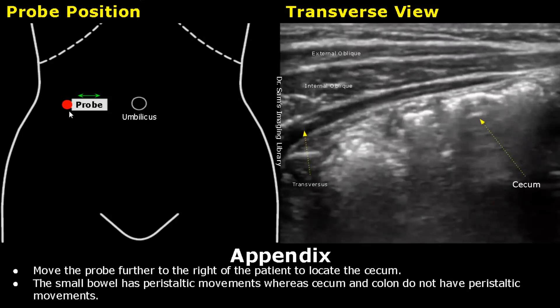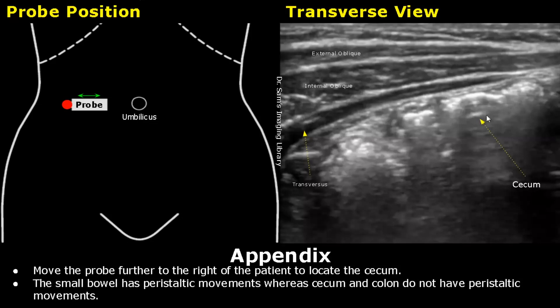Move the probe laterally to the right of the patient to locate the cecum. Here we can see the abdominal muscles in cross-section: the external oblique, internal oblique, and transversus muscles. Below these muscles we can see the cecum. It is filled with gas and gives us dirty posterior shadowing. The cecum will not have peristaltic movements, whereas the small bowel will. That is how you can distinguish a cecum from a small bowel.